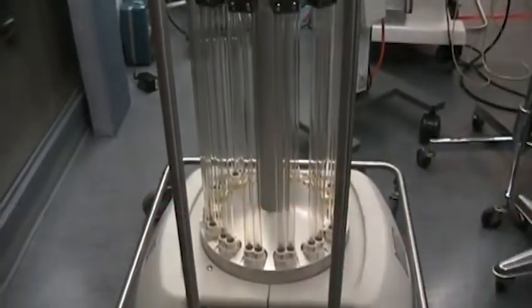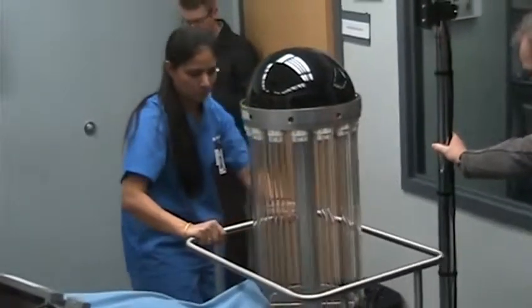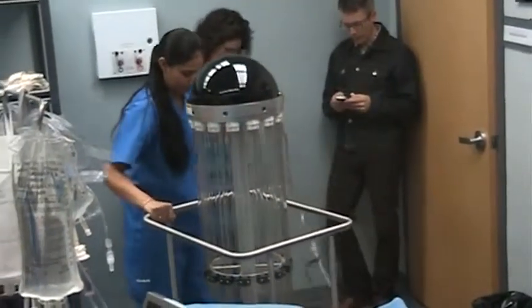What the machine does is it's an add-on to the good cleaning that we already have. So after a room is cleaned, the machine comes in, the room is vacated, the machine is turned on, and UVC light basically disinfects the room.